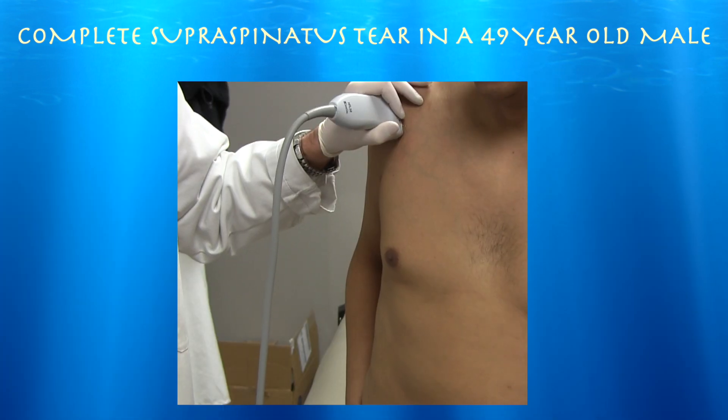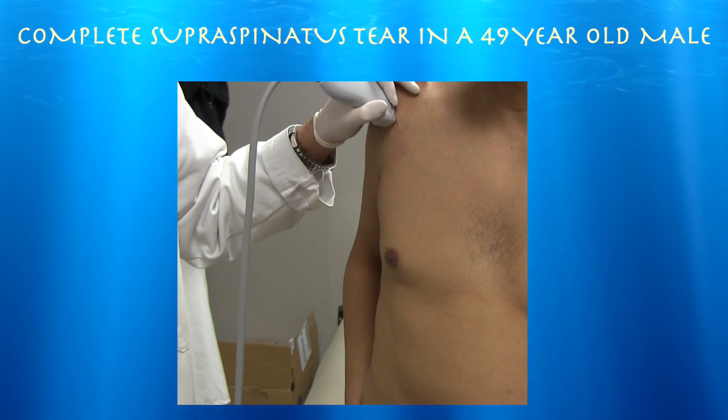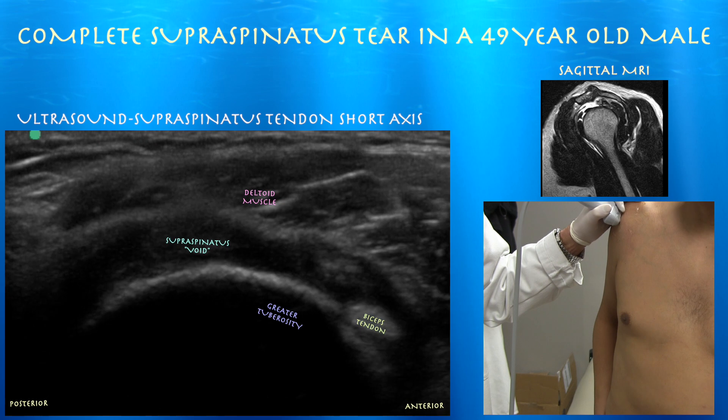We're going to do a short-axis view. You can see the biceps tendon in the groove, going posterior, which is to the left side of the screen, and again just a black space there. Here's that biceps tendon again, which is the anterior margin of the supraspinatus tendon, and there's just a black space or void where you would expect to see the supraspinatus tendon.